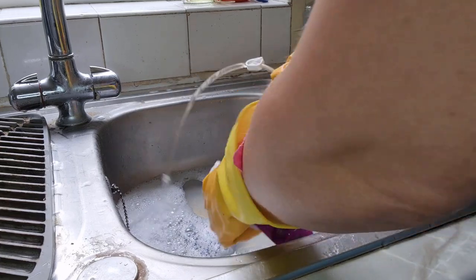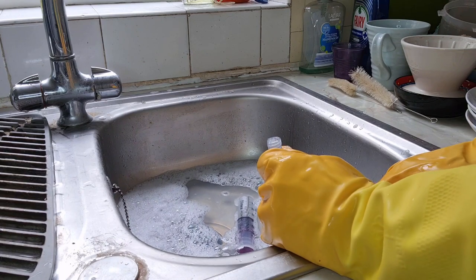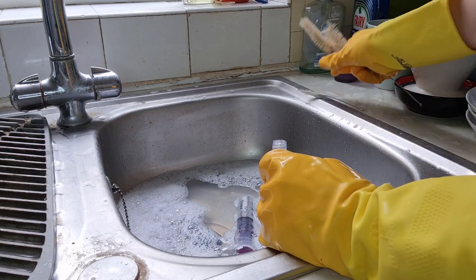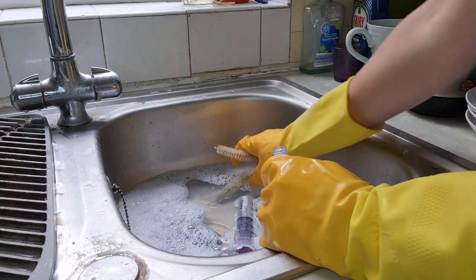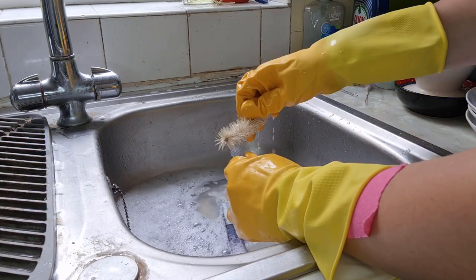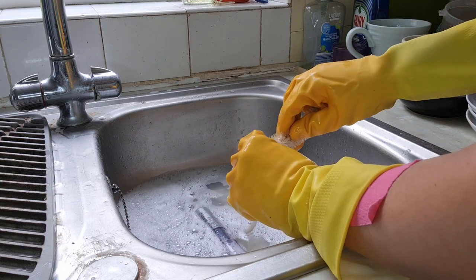Tip number four is to clean the threads. I've heard of people using pipe cleaners, which I think is brilliant. Personally I don't have pipe cleaners, but I have these tiny little brushes — I got a set of three at TK Maxx. I use one to get the bristles in and clean the threads of any food that might be stuck.